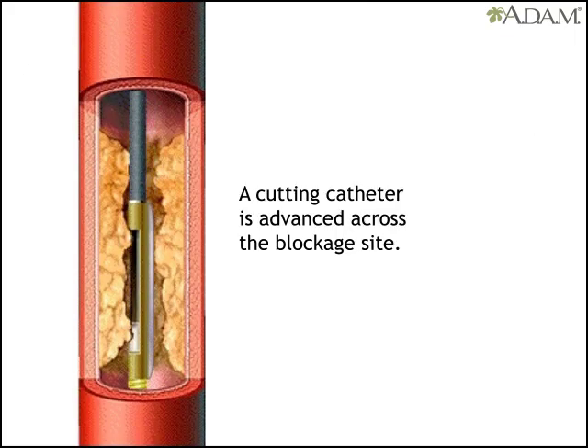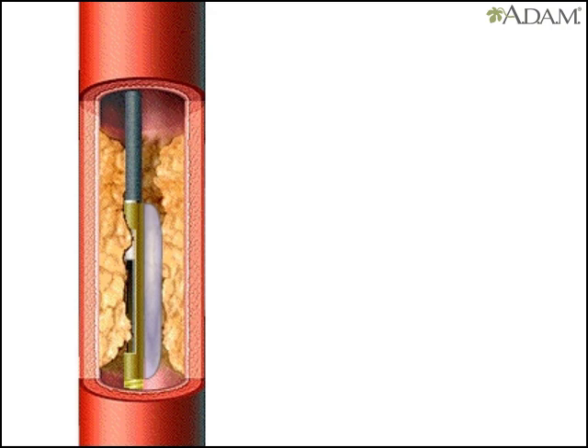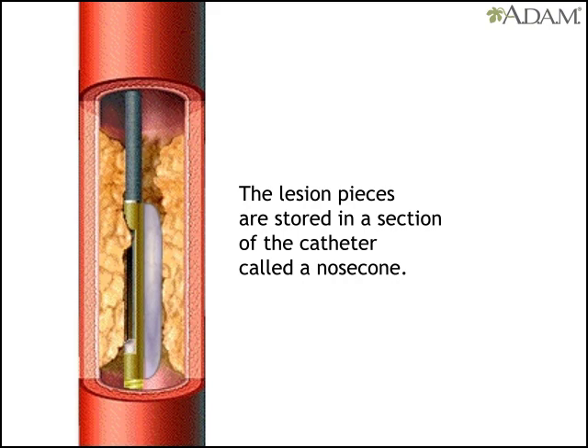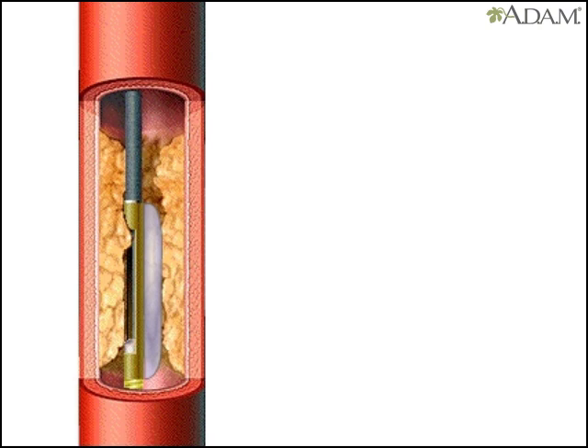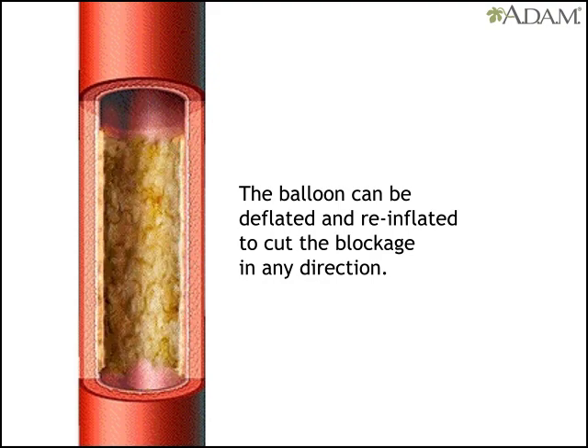Another catheter designed for lesion cutting is also advanced across the blockage site. A low-pressure balloon attached next to the cutter is inflated, exposing lesion material to the cutter. A drive unit is turned on, causing the cutter to spin. The doctor advances a lever on the drive unit that in turn advances the cutter.